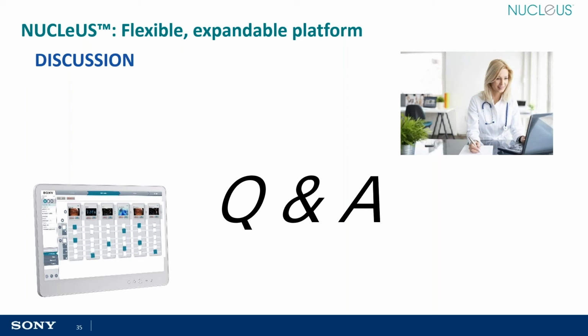In collaboration, do you have case studies or other documentation other than the Sony camera and NUCLEUS? How are you specifying the audio annotation? So in the collaboration case, as I talked about, you can use another third-party RTSP encoder. We're working with a couple of manufacturers now, IP cameras which are already RTSP enabled. Again, same answer as before: we'd have to validate those.